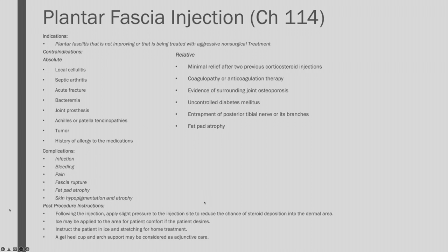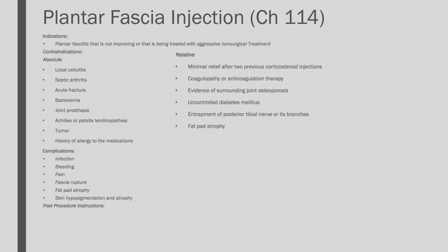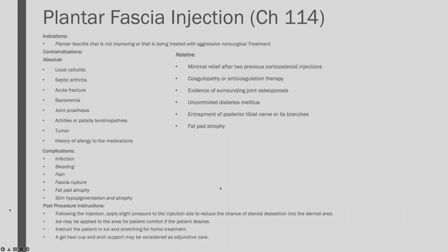After you're done with the procedure, you're going to apply some pressure, reduce the chance of steroid deposition in the dermal area, ice. And I think in a lot of these procedures, what we've been seeing them use is the ELSA spray, ELSA from Frozen. It is called ethyl chloride, and we spray it at the area to help numb it before we finish inserting the needle in. So we'll spray that, it freezes the skin, we insert the needle in. We only have those in fancy offices. We certainly don't have that in the ER.